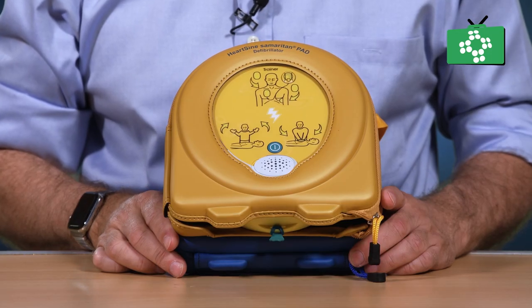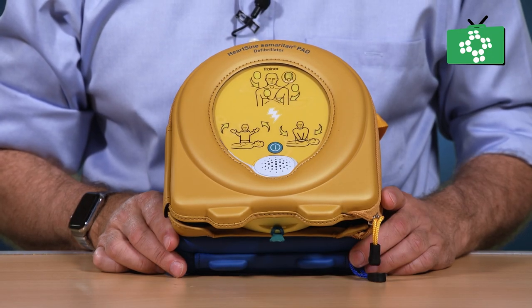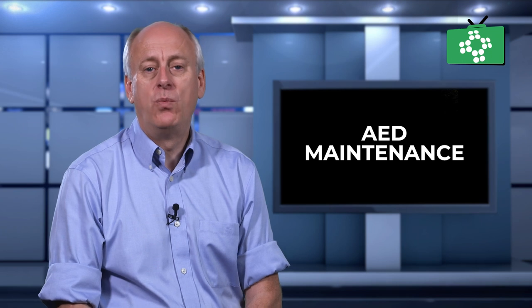Initial checks are quite straightforward. Most AED units have a flashing light that indicates the unit is functioning correctly. A warning sound or beeping noise could indicate there is a problem with the unit or that the batteries are low.